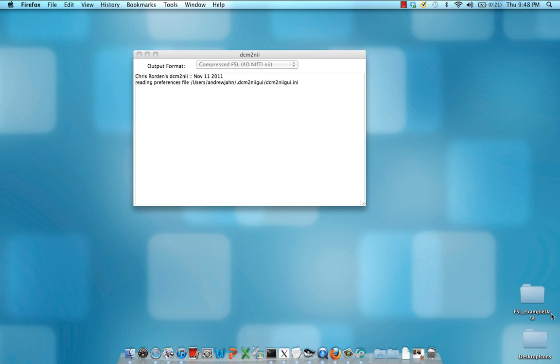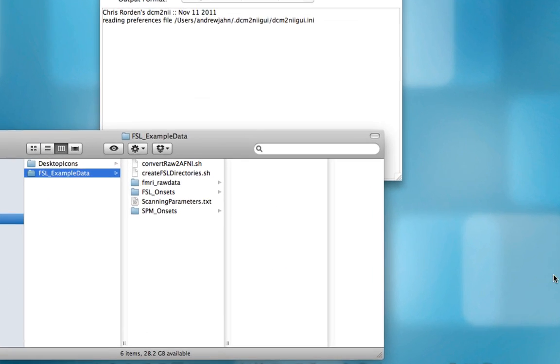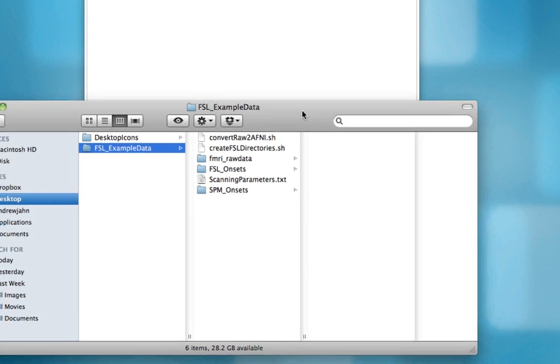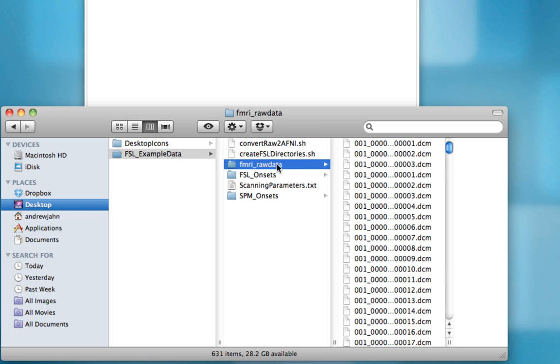I've already downloaded it to my desktop right here, so let's go ahead and see what's inside. You can see we have a few different directories and a couple of different scripts, which we'll focus on later. For now, look within the fmri underscore raw data directory.